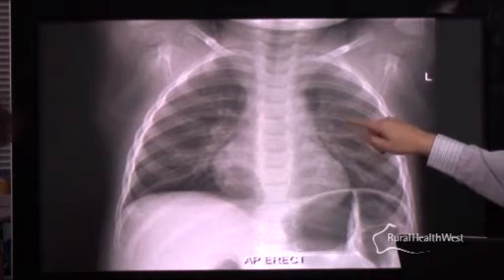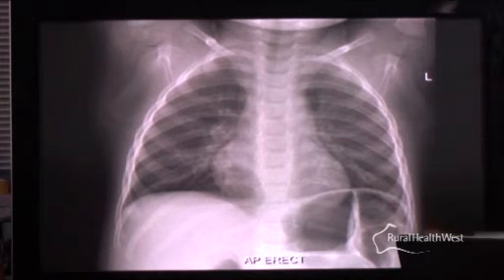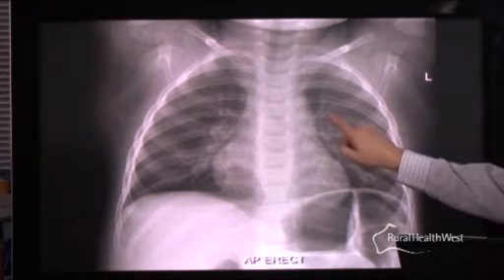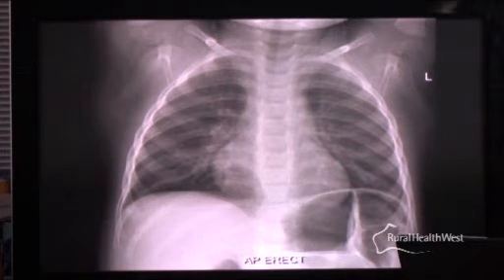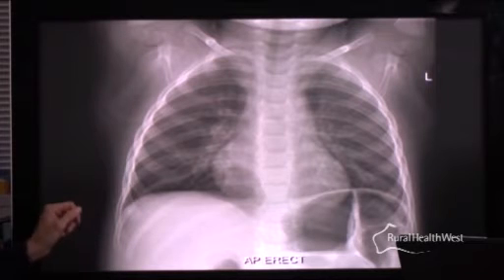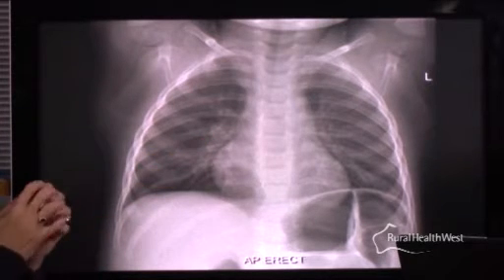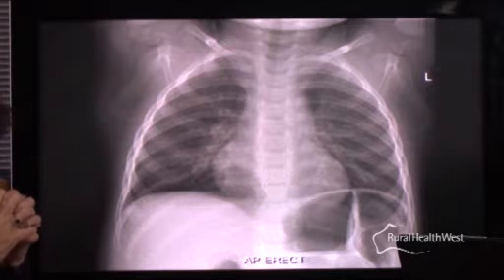When you look at the lung fields, all the bronchovascular markings going out into the periphery are all a little bit prominent, and when you look at the individual bronchi end on, there's a bronchus there end on, you can see that it's thickened and cuffed, and so there is peribronchial inflammatory change and interstitial infiltrate that goes out into the lung fields. Yes, there is that as well, so on the right side of the chest film.